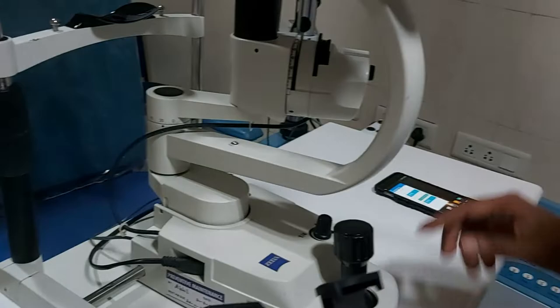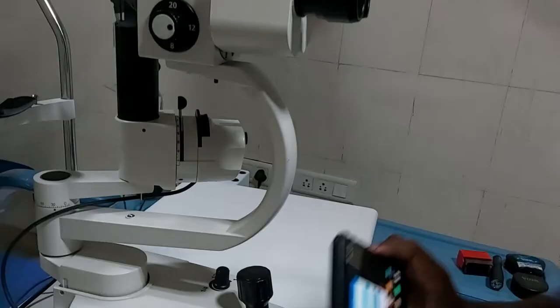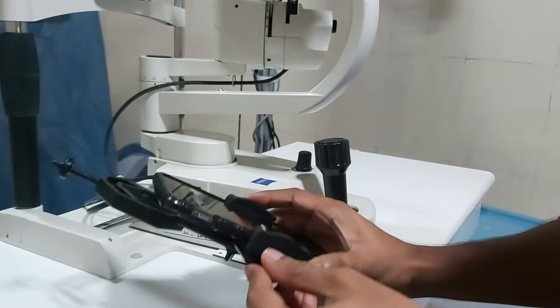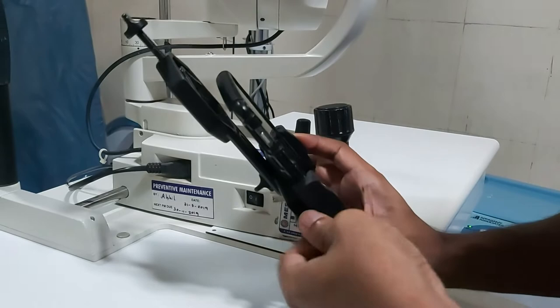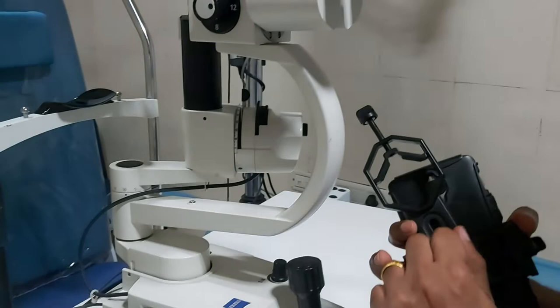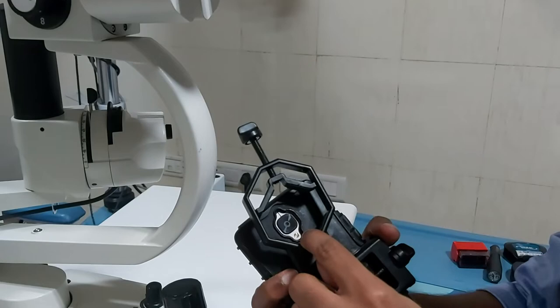Take the phone and, making sure that the buttons are not pressed, place the phone into the phone holder part and tighten the phone holder knob until it is fixed securely. Then turn on the camera using the camera shortcut and adjust the position of the eyepiece holder part to the center of the camera.